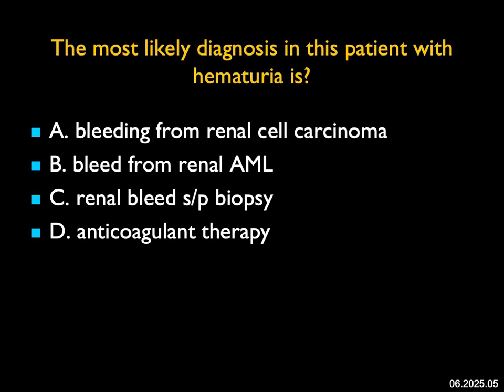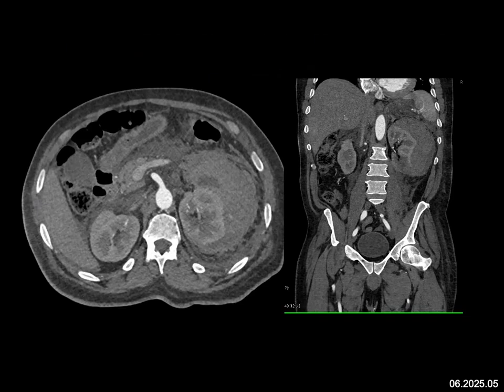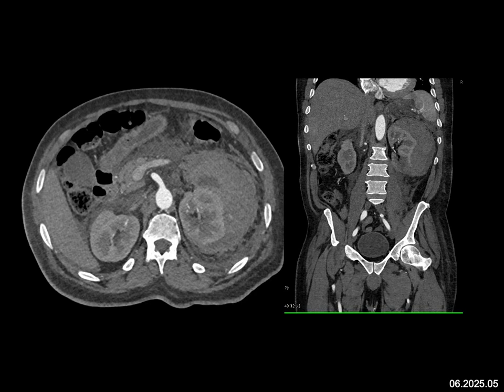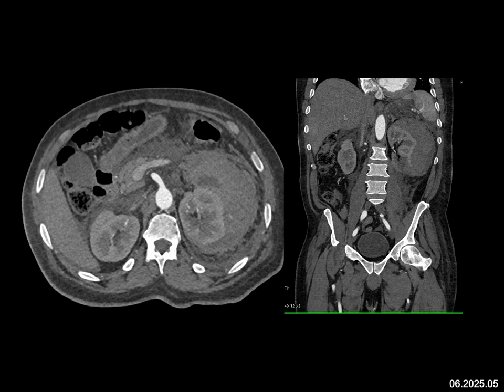The most likely diagnosis in this patient with hematuria: there is a large perirenal collection. Perirenal collections can be due to bleeding from trauma — iatrogenic like a biopsy, an MVA, a stab wound, or a gunshot wound. Things in the perirenal space could be related to tumor like lymphoma, extramedullary hematopoiesis, or other conditions. But I don't see a mass, so I don't see a renal cell carcinoma — which can bleed — nor do I see an AML. Anticoagulant therapy usually produces a smaller bleed. The most likely diagnosis is trauma; the patient had a recent biopsy. A very nice example of perirenal hemorrhage post-biopsy.